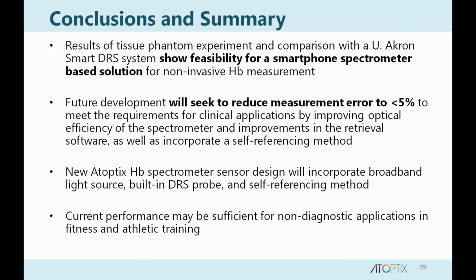In conclusion, this shows pretty decent feasibility for such a system to have a compact hemoglobin sensor that connects to a smartphone. Pretty exciting stuff.